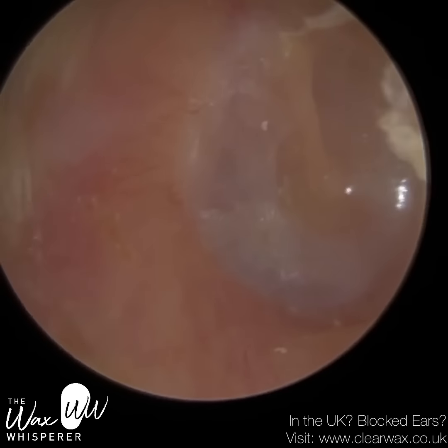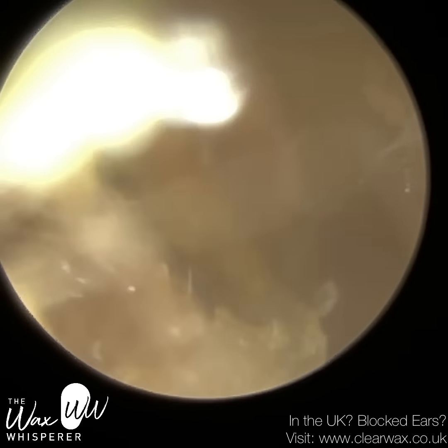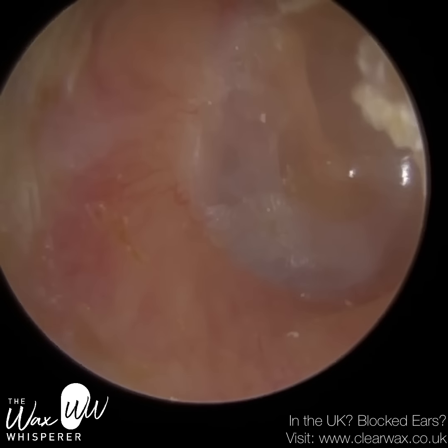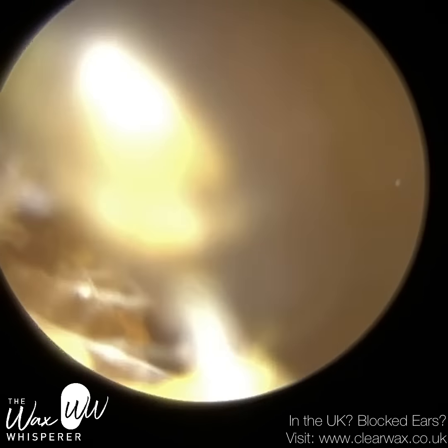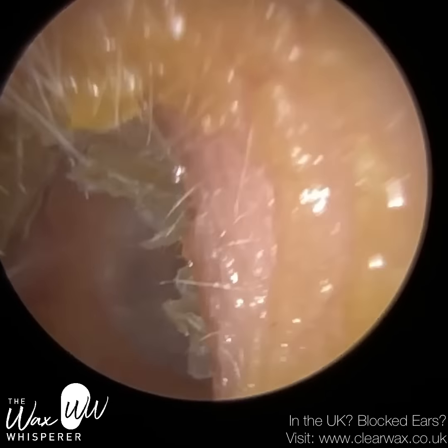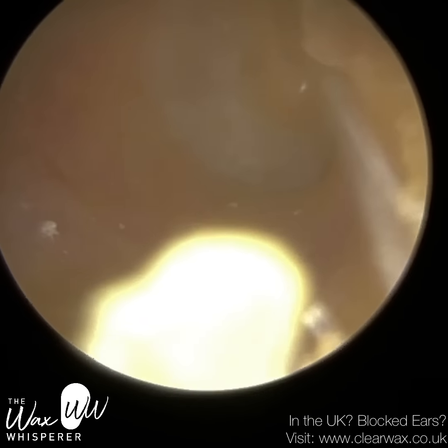It reduces the suction power. Although it's reduced suction power, sometimes you can get more suction because of the smaller surface area. So as you know, the smaller the surface area, the greater the pressure. So although the sucker is smaller and it's quieter, in some instances it can be a bit more powerful because it's the smaller surface area, and because the suction's concentrated on just a small part of the dead skin, which can sometimes have a greater net effect.